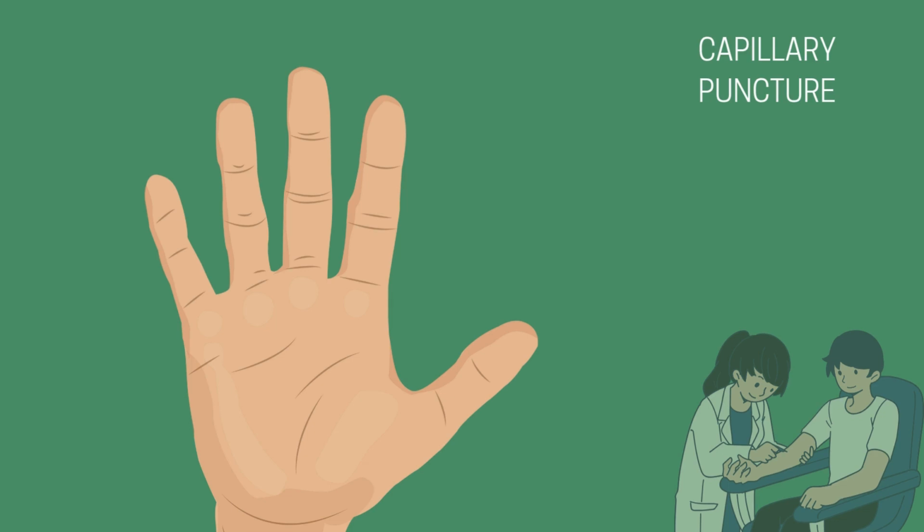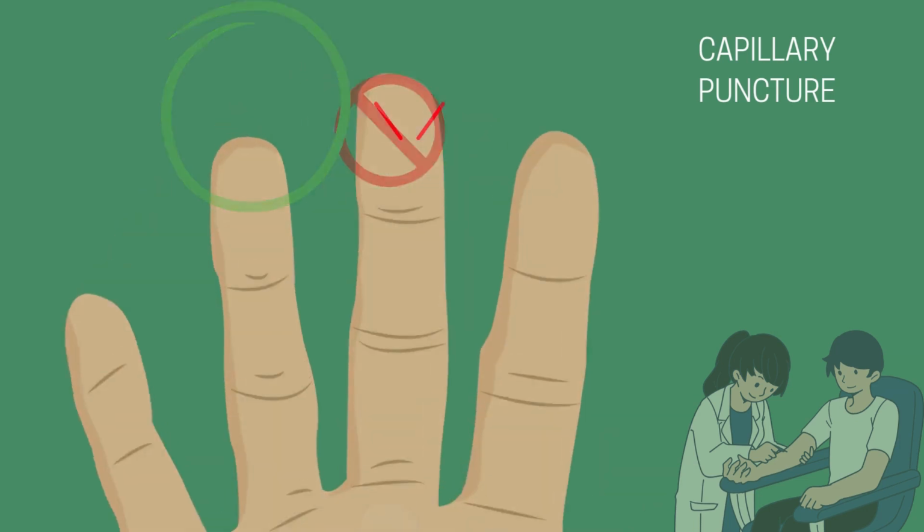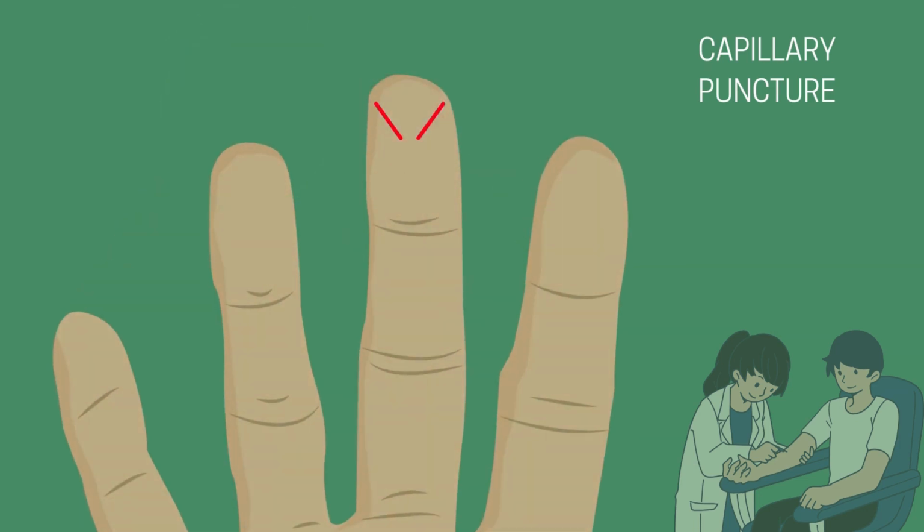For adults and older children, the most common site is the side, or the lateral aspect, of the fingertip. And as the index finger has the most nerve endings, the middle or ring finger of the non-dominant hand is usually the best choice. They have fewer nerve endings and are less likely to cause discomfort or complications. The pad or center of the finger and the thumb should be avoided due to higher nerve density and callous skin. See the diagram above for proper location.